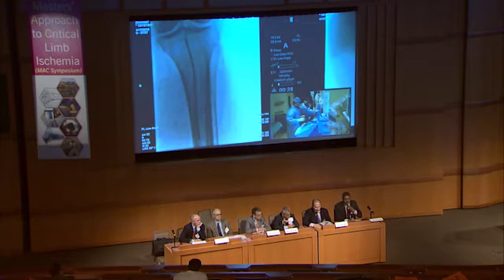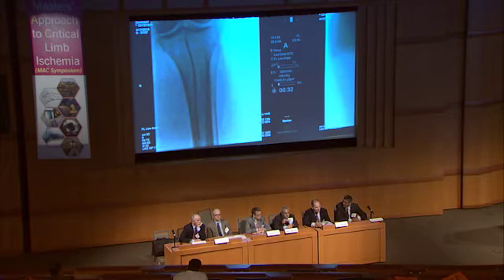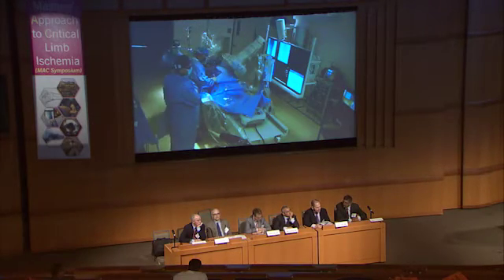Well, first of all, I'd like to commend Dr. Burkett for his very nice hemodynamic description. It's completely true about the effect of these fistulas proximally and distally. If you have a situation of critical ischemia and edema, and that is likely caused or at least exacerbated by that fistula, you have to treat that fistula. You don't need to treat it necessarily today, although certainly putting a Viabahn in it and not treating it would make me nervous. You're going to have to treat it at some point.